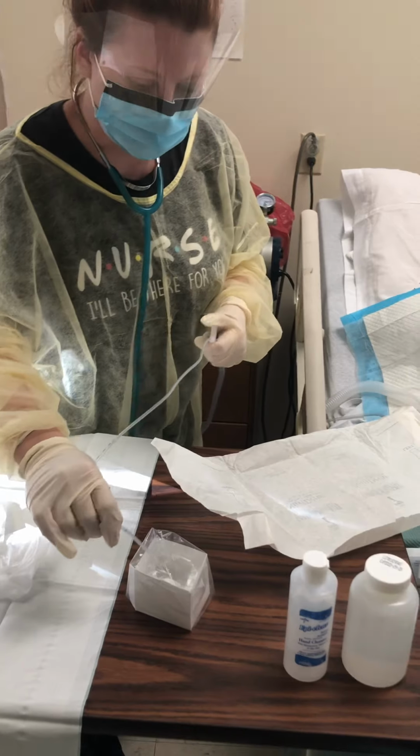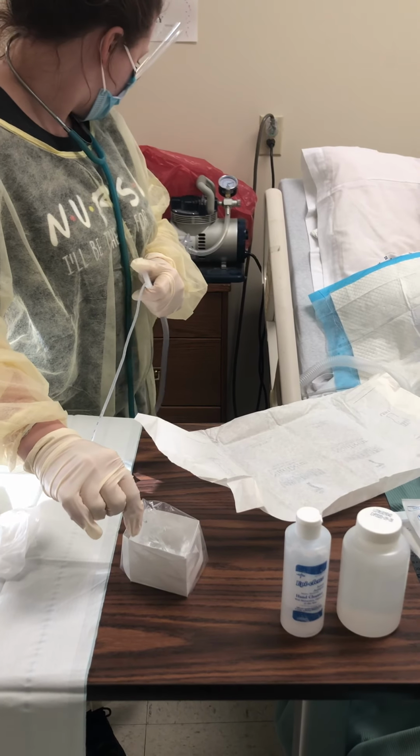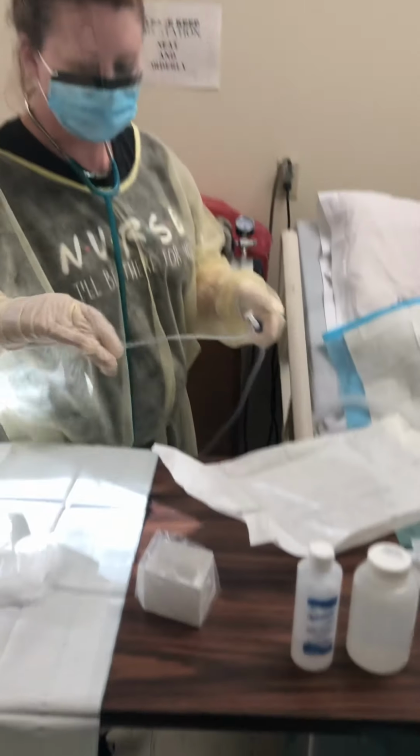To test a little bit with my sterile water, and it is suctioning properly.